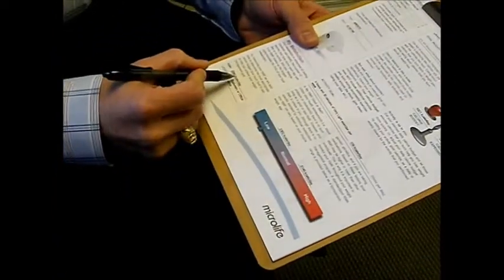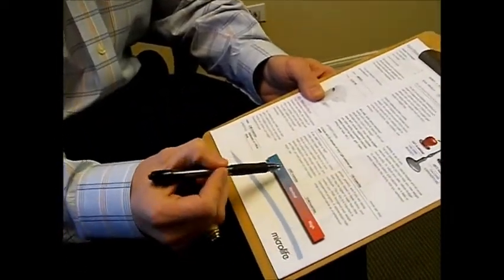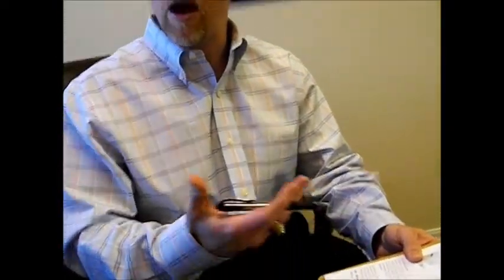Okay? So when we look at where you're at, this is your metabolism here. This is what you burn all day, every day at rest. You burn a pretty good amount of calories, but a normal range for you is really between about 2,300 and 3,100. That's a big range, and the reason is the amount of your overall body weight. Where you're at with your weight, it would support a higher metabolic rate. If you think of it, a person that weighs 300 pounds requires more energy to sustain that weight than a person who weighs 200 pounds. So even though your metabolism is below a normal range for you, you still burn an abundant amount of calories.